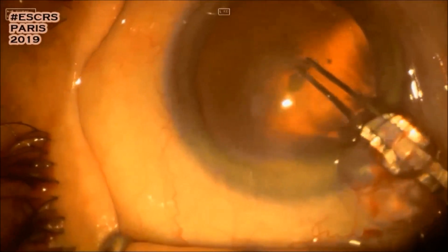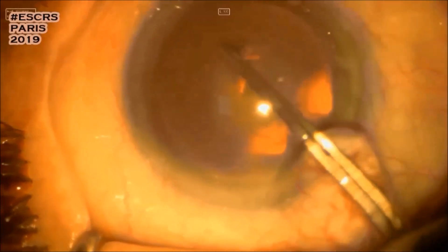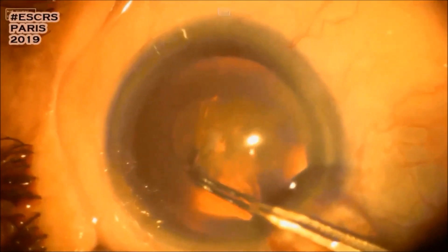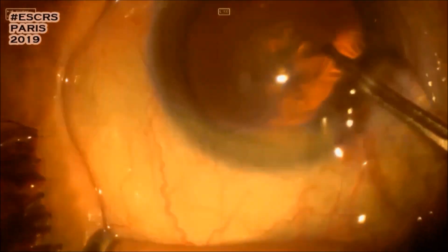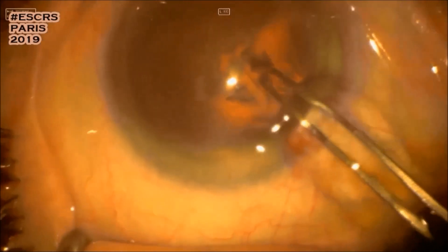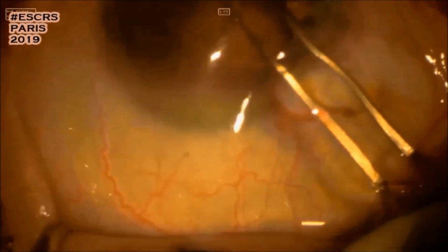Here comes the capsulorrhexis being made with forceps. It's smaller than I wanted it to be.